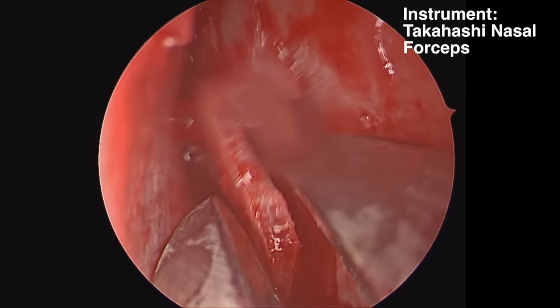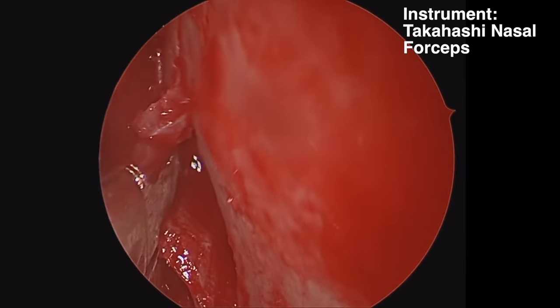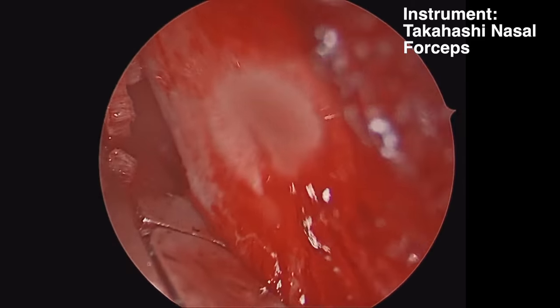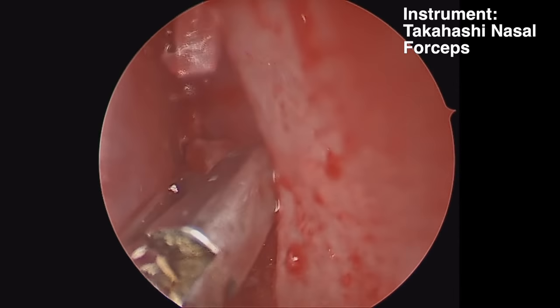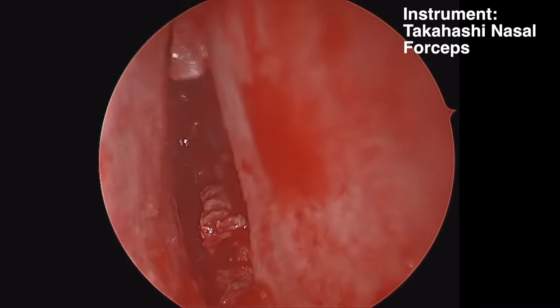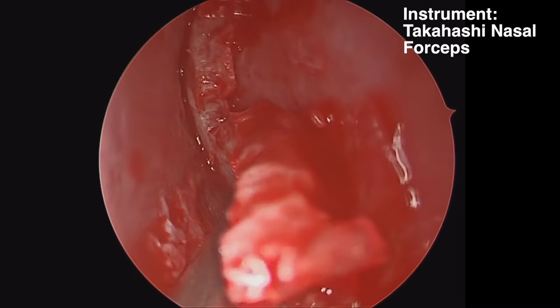Next, we're going to use a Takahashi forceps to remove the deviated portion of septal cartilage and then the bony septum. When removing this bone and cartilage, you want to be sure you have a superior incision so that you are not fracturing this off the skull base. You can twist it after you've made a superior cut and remove it. If you have a sharp spur, take care to remove it carefully so the sharp edge doesn't tear your mucosa.